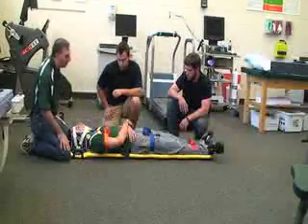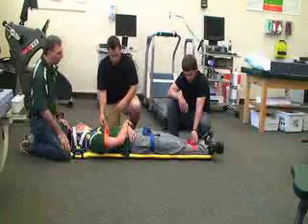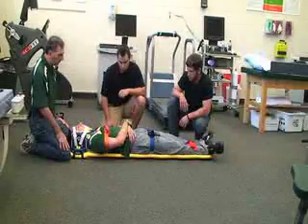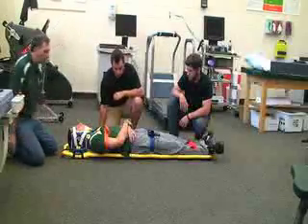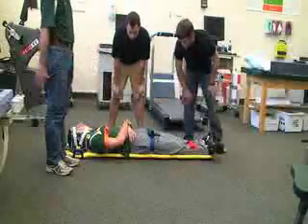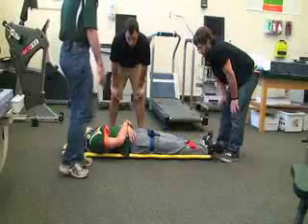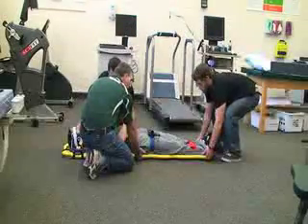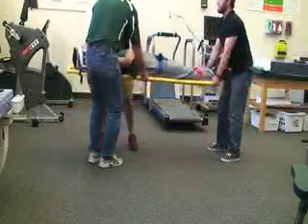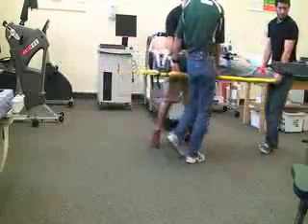If needed, we can tie the hands to help stabilize them. Check to make sure everything is secure before we lift — if anything needs to be tightened, do that now before lifting the patient. When we lift, we want an even number of people on both sides; ideally four would be good, two at the shoulders and two at the feet, all in sync. We're going to bend at our knees, grab the handles, and on the count of three we lift: ready, one, two, three — lift. Then we can go ahead and walk them off.